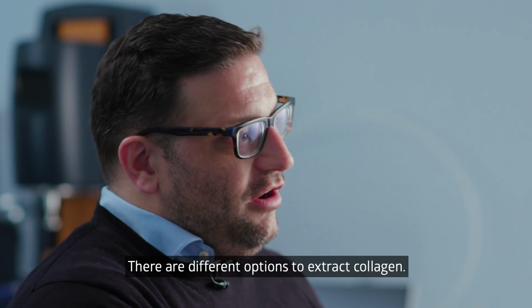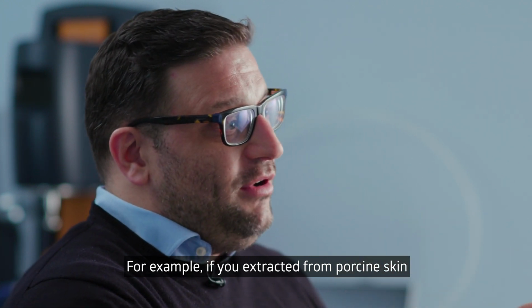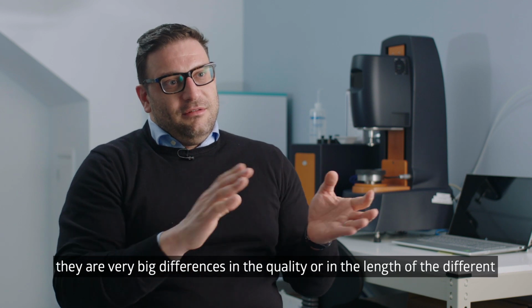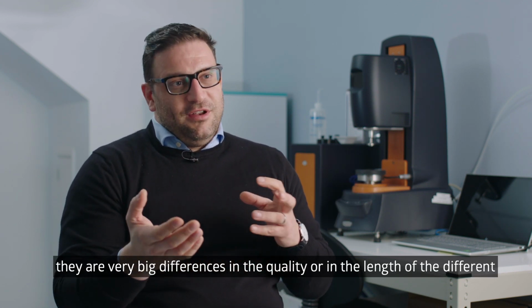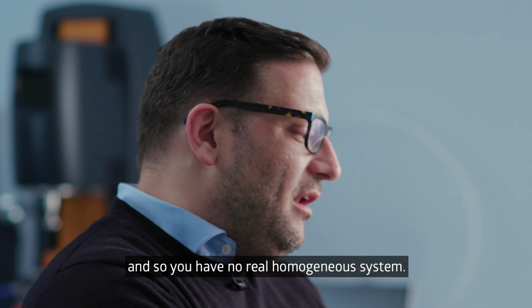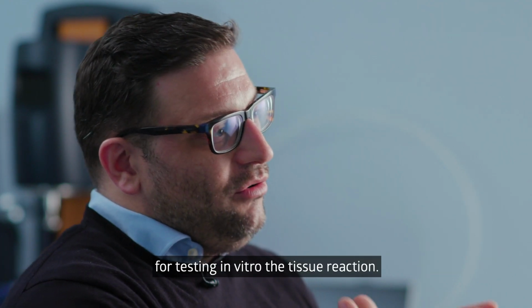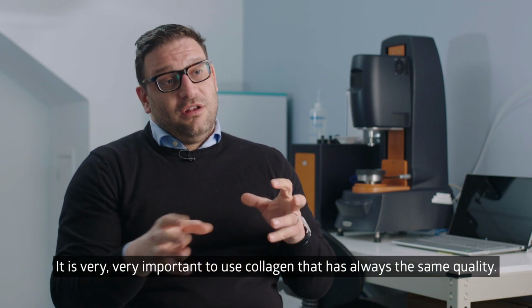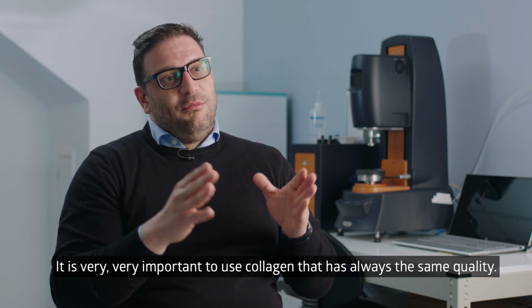There are different options to extract collagen, and if you, for example, extract it from porcine skin, there are very big differences in the quality or in the length of the different fibrils of collagen, and so you have no real homogeneous system for testing in vitro the tissue reactions. It is very, very important to use collagen that has always the same quality.